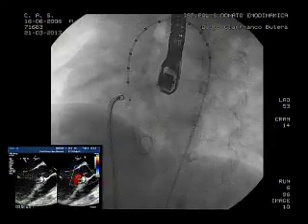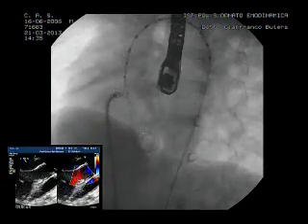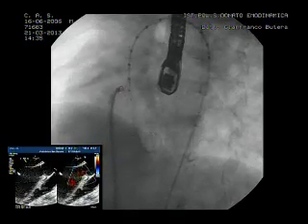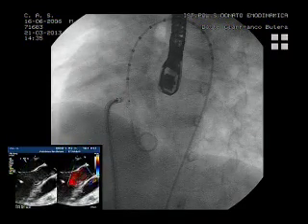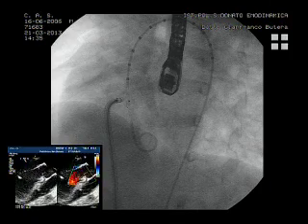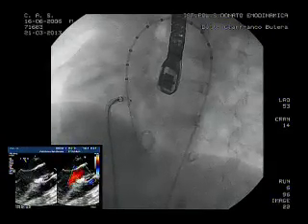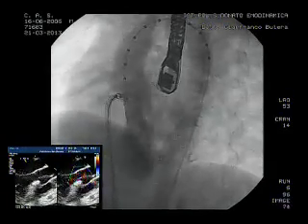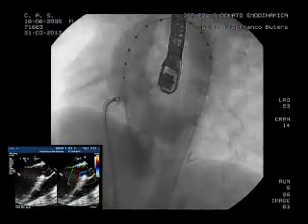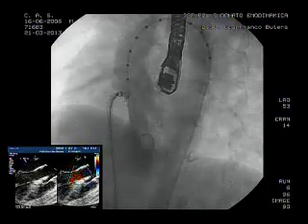Yeah. So you can see the aortic valve leaflet is moving nicely, actually, not bad. The trivial AR, which was there before, and don't forget we have a catheter. Can you play it back, please? So you can see it there playing back, right? You can take a look at the echo also. It looks great. So show them also a big picture on the echo.